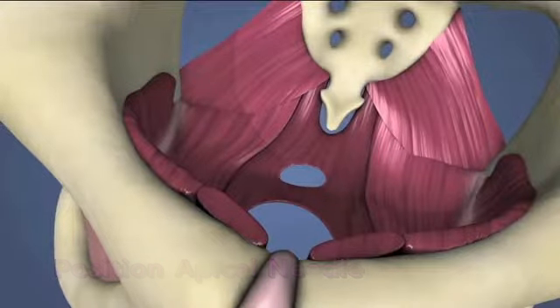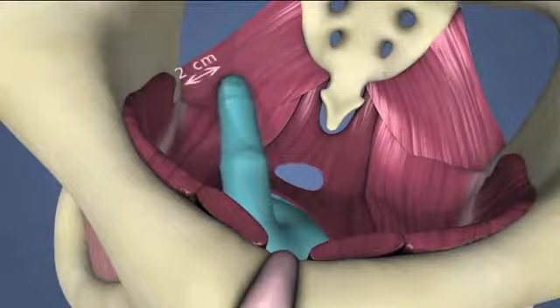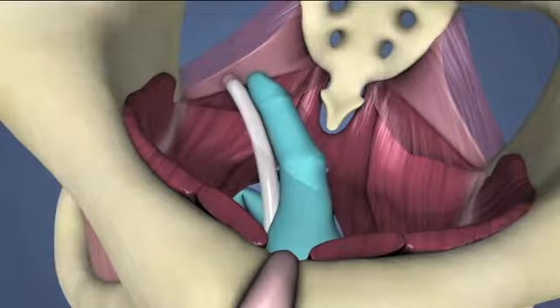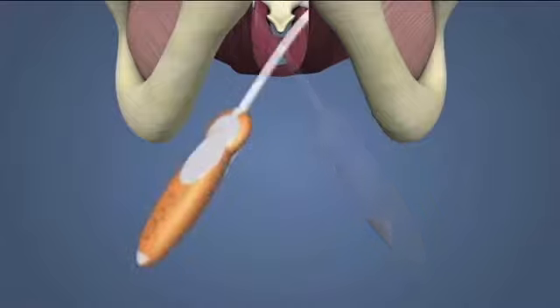Positioning the apical needle. To position the apical needle, locate the sacrospinous ligament by palpation. While keeping your palpating finger on the ligament, guide the tip of the loaded needle and sheath alongside and lateral to the finger towards the ligament. For patient left, hold the needle in the 5 o'clock position. For patient right, hold the needle in the 7 o'clock position.